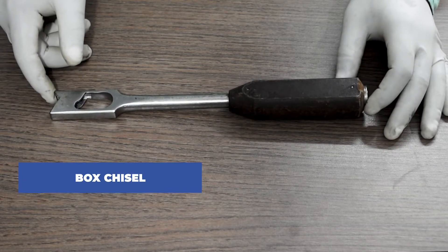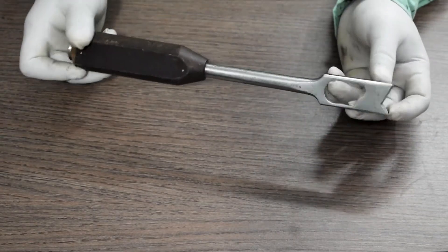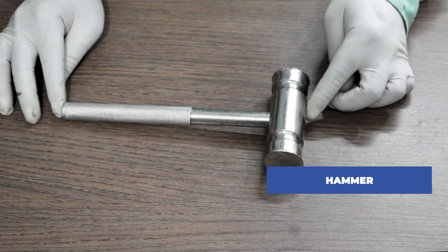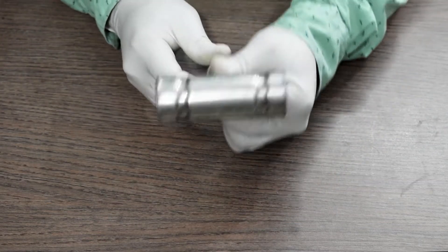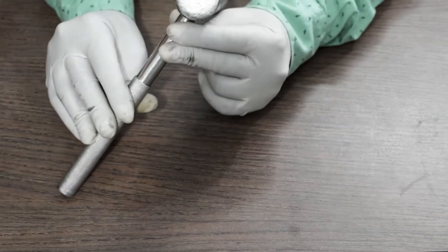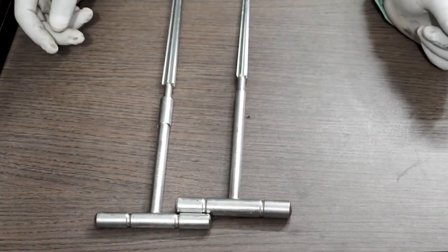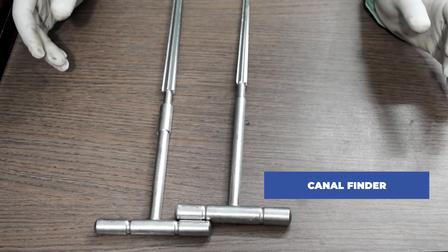Now let us understand all the instruments required to do the surgery. First we start with a box chisel, next a hammer, and then the canal finder, which is also called a straight hand reamer.